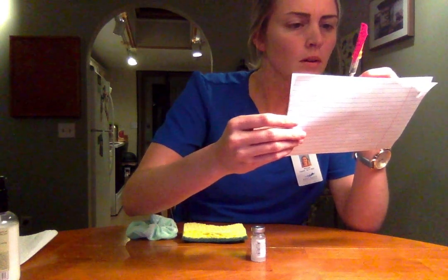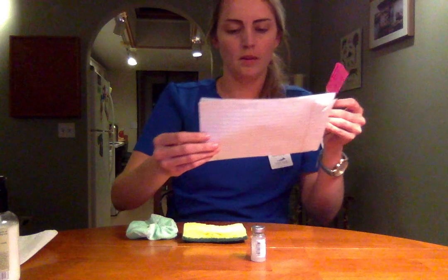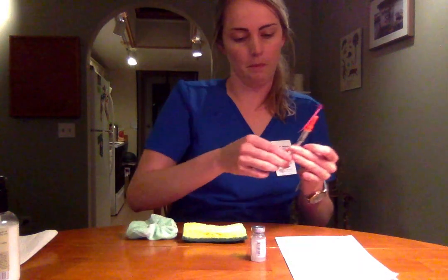All right, I have the correct amount, 26 units. 26 units is written out, and I'm going to verify. Okay, and I have 26 units in the syringe here. The route is subcutaneously, okay, and the time is stat, and I will document later.